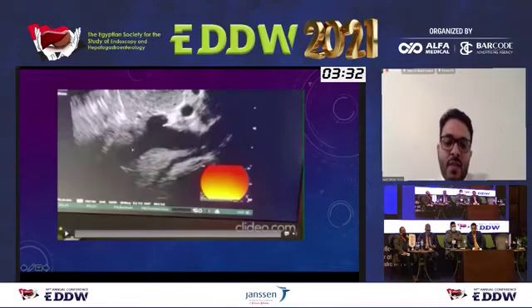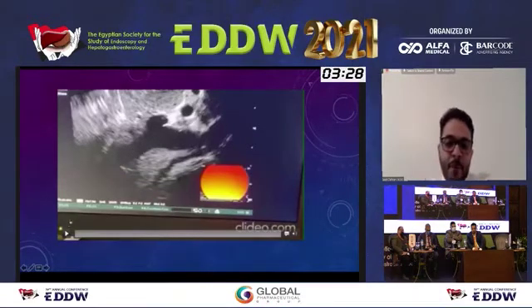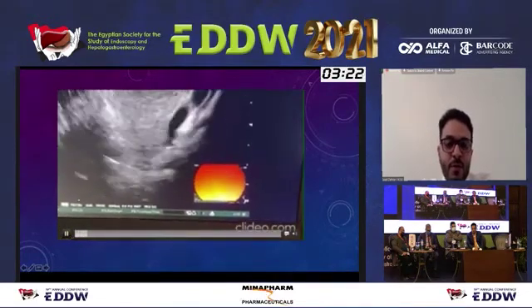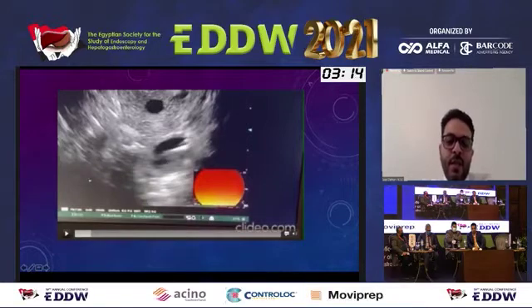I'm going to share with you a few cases that I have done this month for evaluation of pancreatic cyst. I'm sorry for the quality of the video. So this is a young female patient. Her age is 34 years old, and she was found incidentally to have multiple pancreatic cysts.